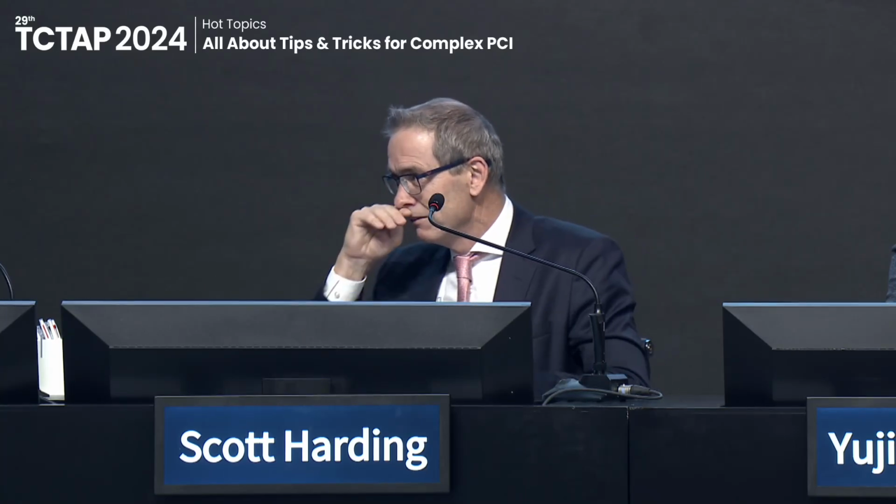If you have residual air in the balloon, which you often see, particularly with 120 pulses, right? Sometimes you'll start with no air, and then after you've delivered 4 treatments, all of a sudden there's air in the balloon. Do you want to make a comment about that? Because it's a really important point. So critical point that Scott's making.